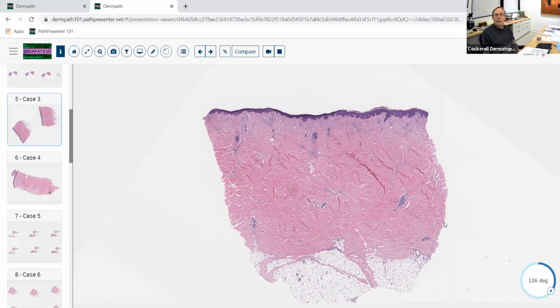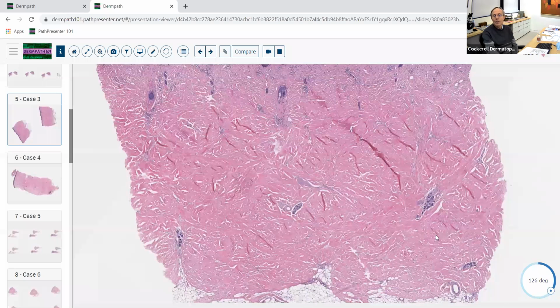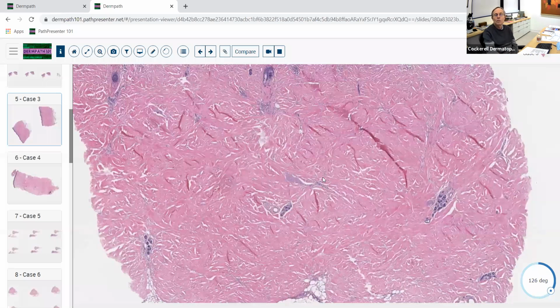Even though it's thick, it usually contracts centrally. It has elastic fibers in there, and it pulls in, and it looks a little bit like a pyramid. It doesn't look like a square. So it looks a little bit different at low magnification. If you see something like that, it favors the diagnosis of one of the sclerosing disorders. And then at higher magnification, you see the features of sclerosis that we just talked about.